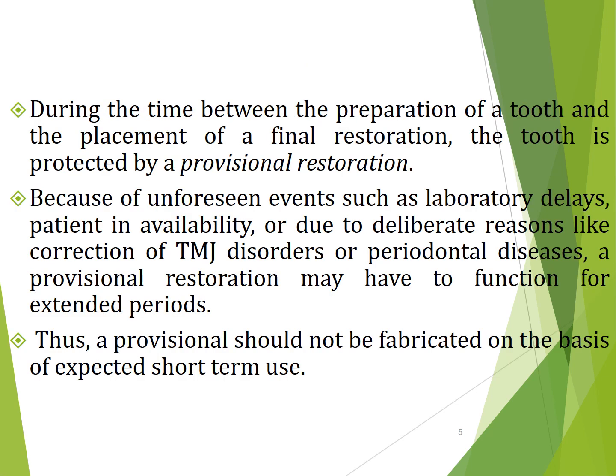So, basically, during the time between the preparation of the tooth and the placement of the final crown or the final restoration, the tooth is protected by the provisional restoration. We cannot really predict how long the lab might take for making the final restoration. So, any delays, patient's availability, or reasons like correction of TMJ disorders or periodontal diseases, provisional restoration may have to function for extended periods.